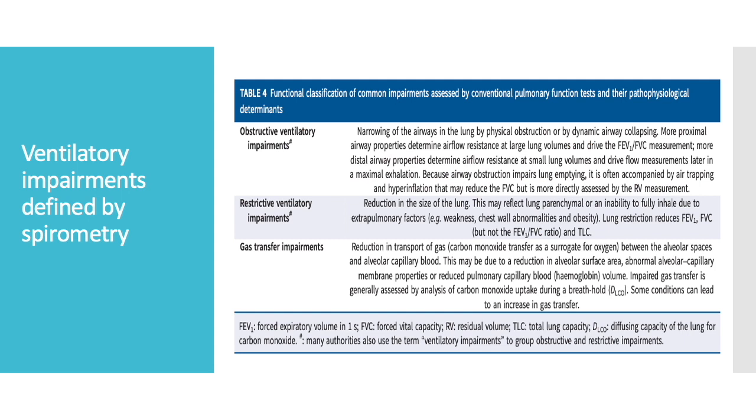So, what are the ventilatory impairments that we can diagnose and classify? We've all been labeling them as obstructive, restrictive or mixed. It's important to emphasize again and again that in normal lungs, your airflow is determined by the expiratory driving pressure, the passive recoil of the expiratory muscles, and the elastic recoil or the viscoelastic properties of the lung.